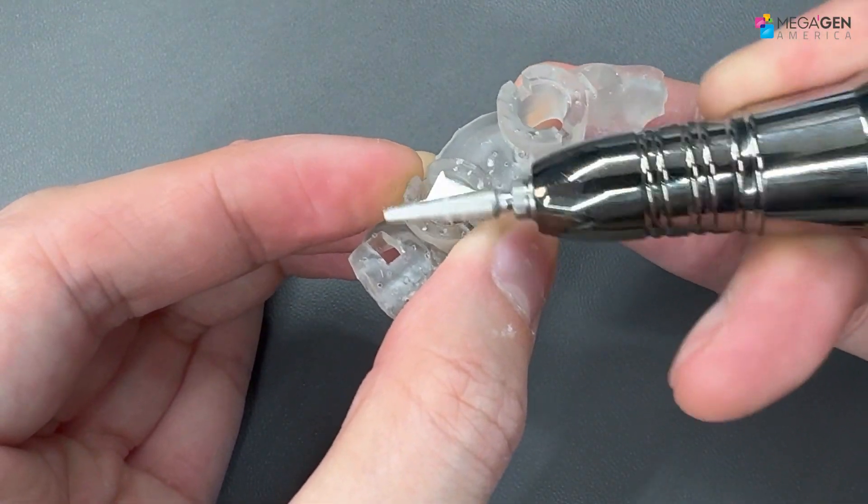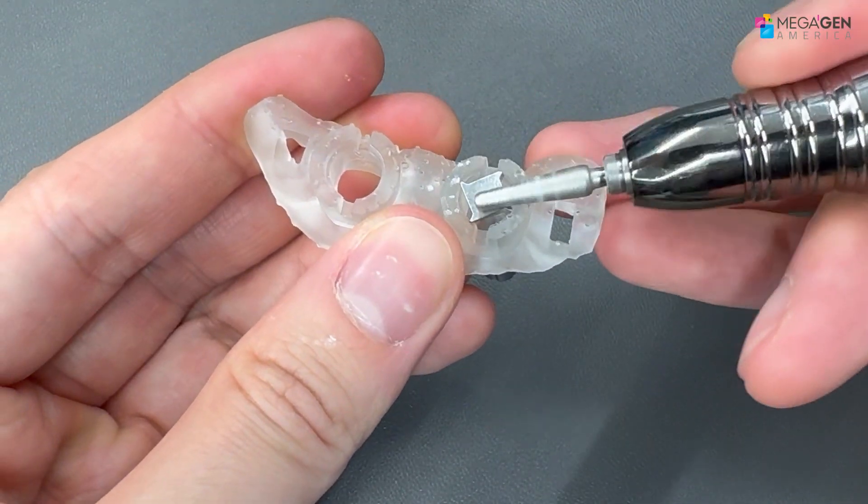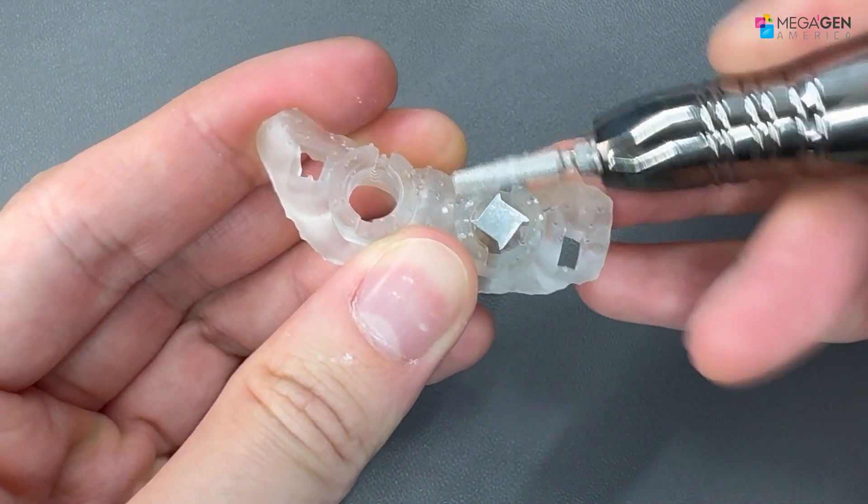When smoothing out the top portion of the drill hole, placing the stopper trimmer in the guide hole can protect the inner portion of the surgical guide.